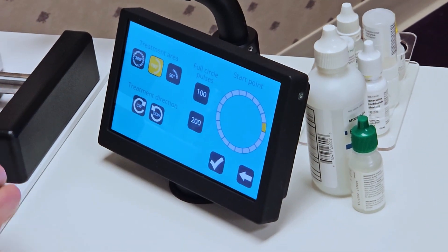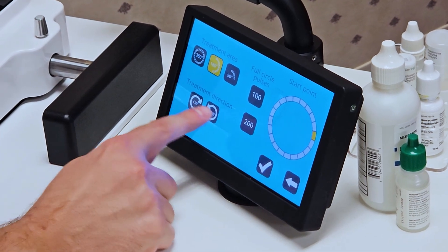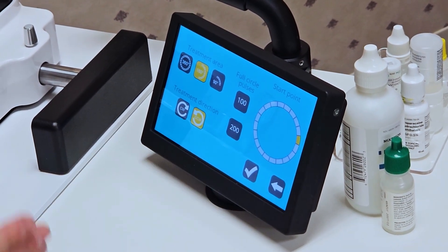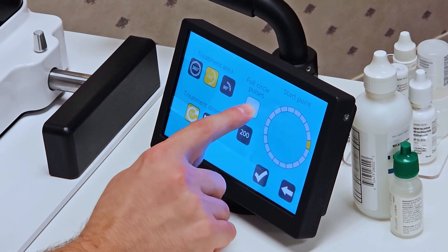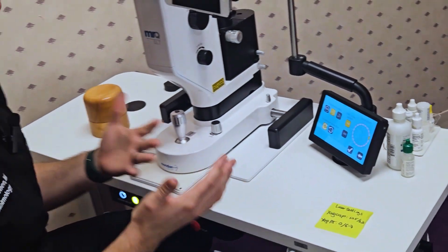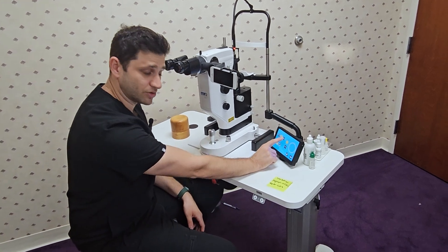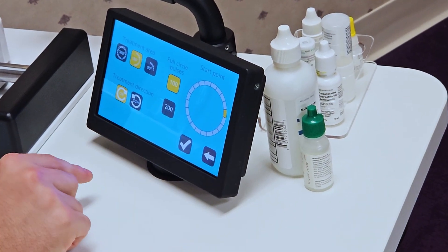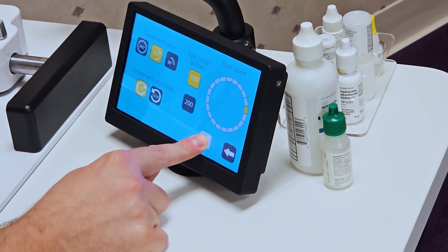If I was doing a full 360 treatment, I would simply do that, but normally I'll do 180. Because I'm starting here, I want a counterclockwise orientation, so I will select that. Now the laser system will know that every subsequent click is going to move this yellow box farther along in a counterclockwise direction. If I go clockwise, then the yellow is going to go down here. So it's really nice — if I'm in the middle of the treatment and I want a quick glance as to where I am, it will count based on the number of pulses where I am. So if I select a full circle as 100 pulses, the computer will know that at 50 pulses I will be 180 degrees away from that starting spot, and it'll tell me exactly where I am without needing anyone else in the room.